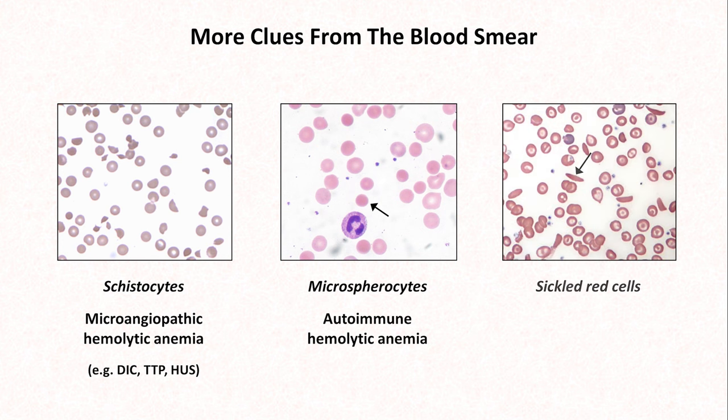And here are sickled red cells seen in sickle cell disease. This slide also has many so-called target cells, in which extra membrane relative to cytoplasm results in a central protrusion in the biconcave disc, looking like a red dot in the middle of the central pallor. This is seen in sickle cell disease as we see here, but also in a number of other disorders such as thalassemia, so the presence of target cells is not quite as diagnostically helpful.